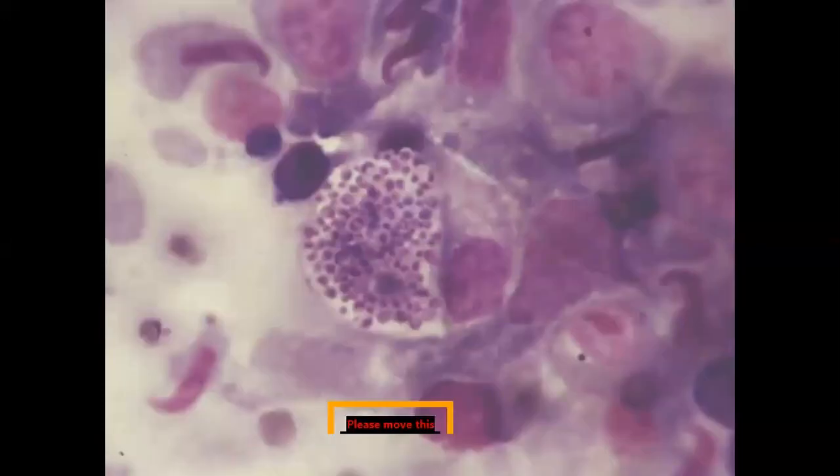See this? This is one good diagnostic feature of histoplasma, that histoplasma spores can be seen in a macrophage.